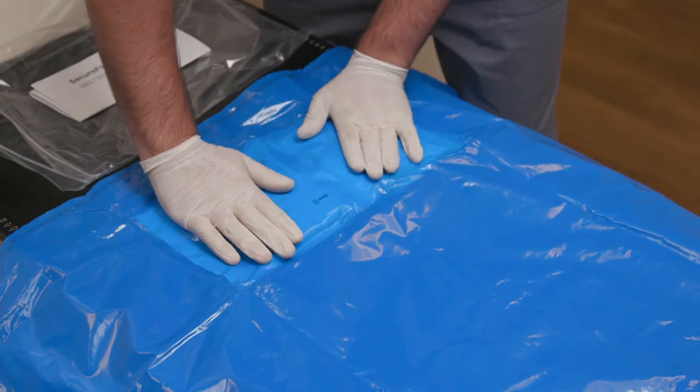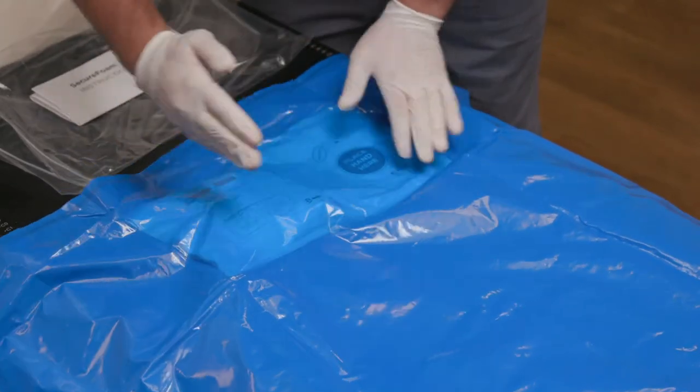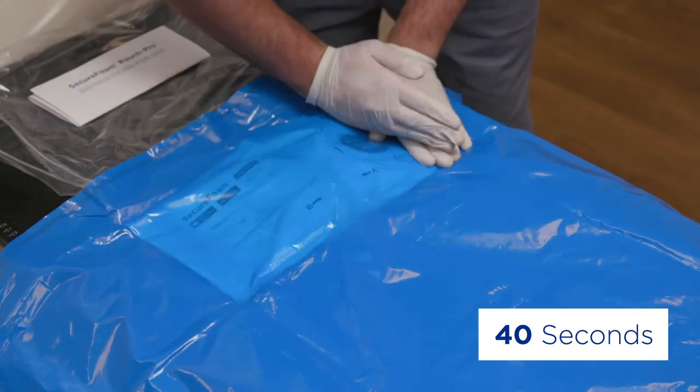The A and B components will begin to mix inside the pouch. To help the mixing process, knead the contents together. Use a wiping motion for about 40 seconds.